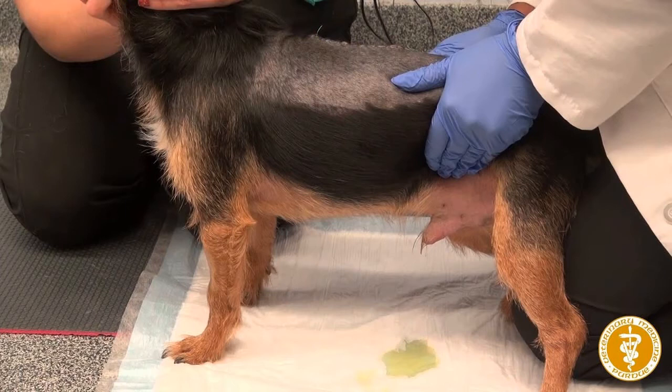In paraplegic animals, this can be done on lateral recumbency. Note that it is not your palms doing the compression, but your fingers put together. Once you have palpated the bladder, you put gentle pressure on it until urine comes out of the urethral orifice, as seen in this image. This is commonly done electively for patients undergoing abdominal surgeries like spay and cystotomy to make the bladder smaller, making visualization of the abdominal organs easier. Remember, this can only be done if the urethra is patent and no obstruction exists.